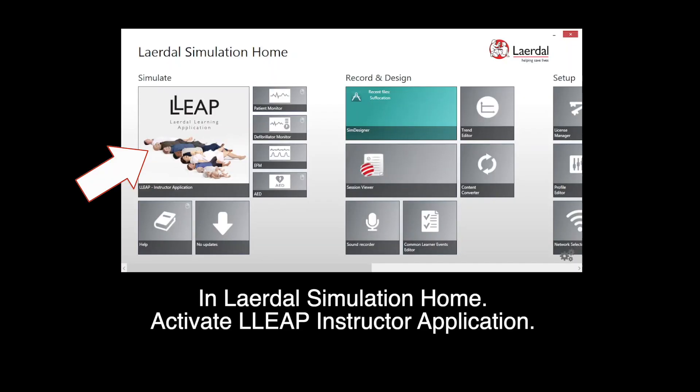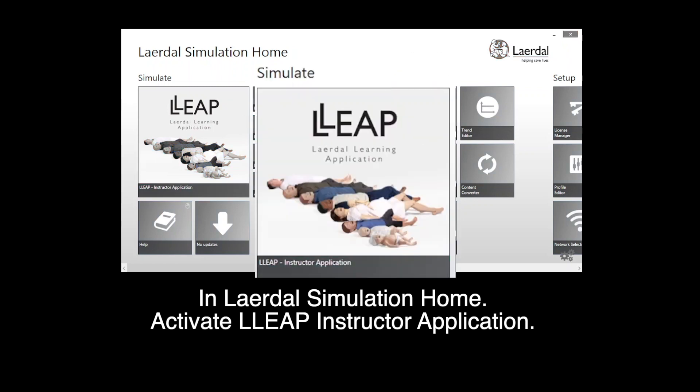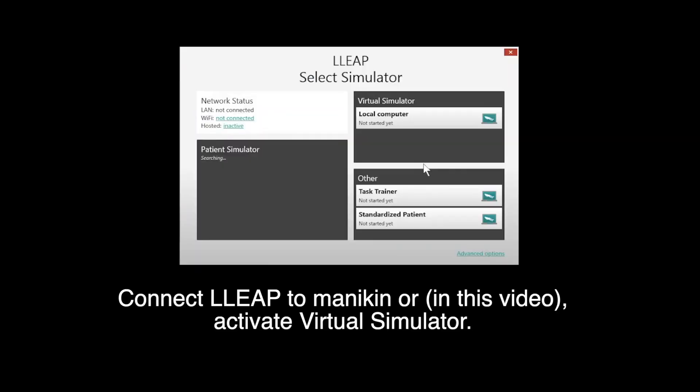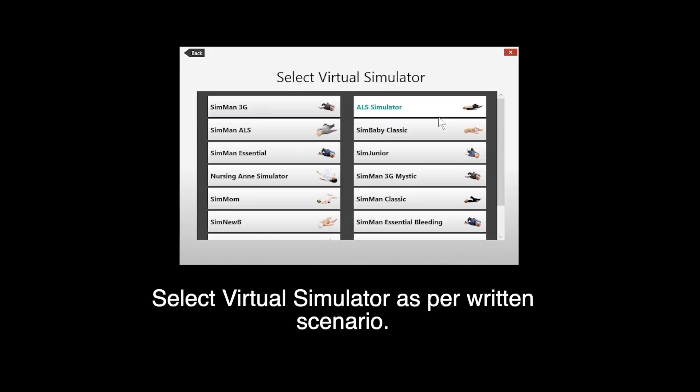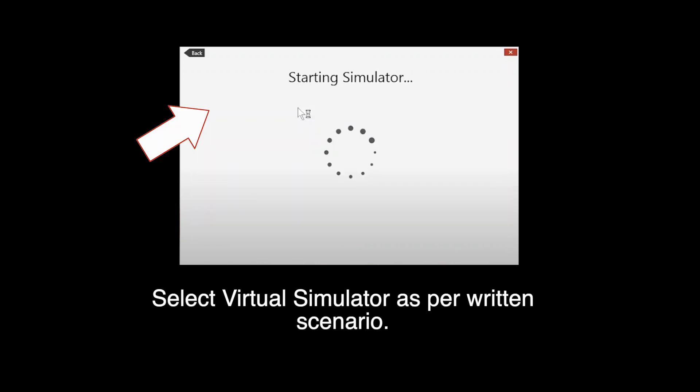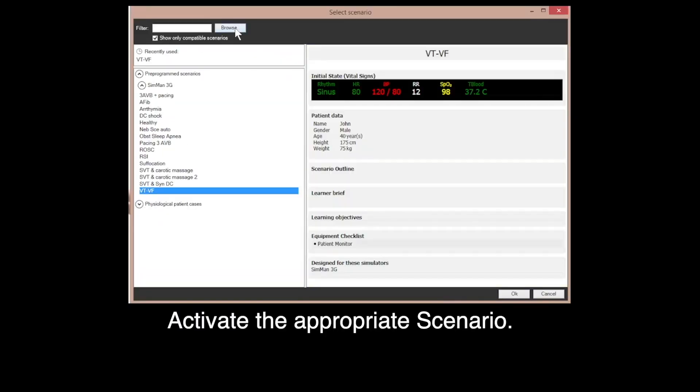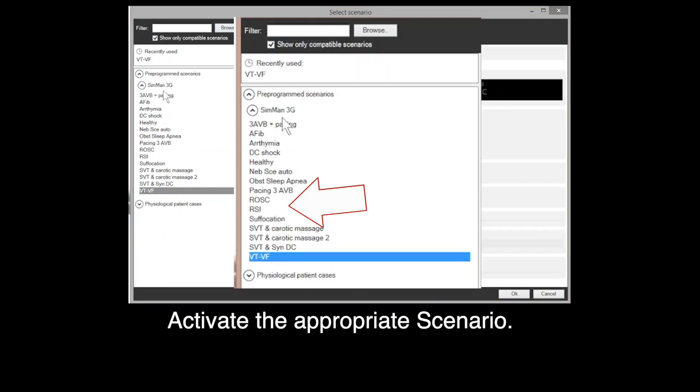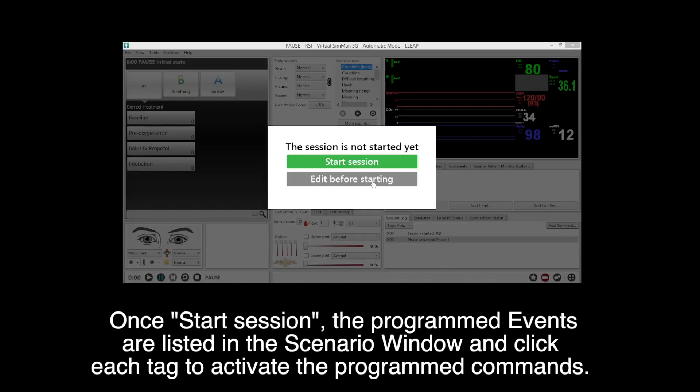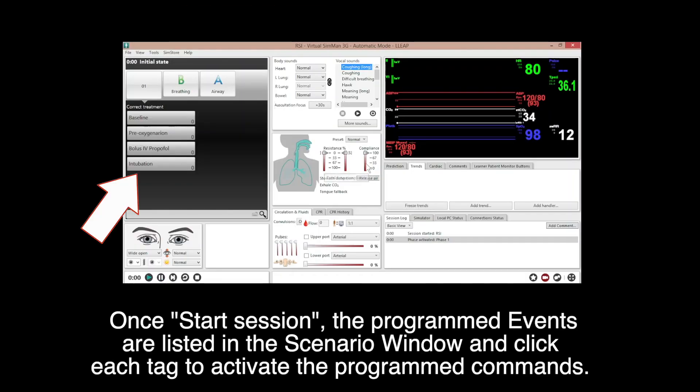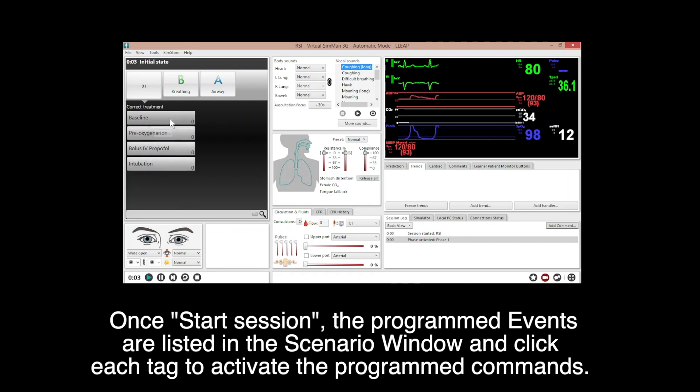Open program scenario in LLEAP. In Laerdal Simulation Home, activate LLEAP instructor applications. Connect LLEAP to MANIKIN or activate virtual simulator. Select virtual simulator as per written scenario. Trigger automatic mode to reach for program scenario. Activate the appropriate scenario. Once start session, the programmed events are listed in the scenario window and click each tag to activate the programmed commands.